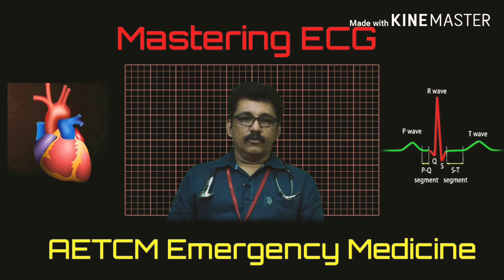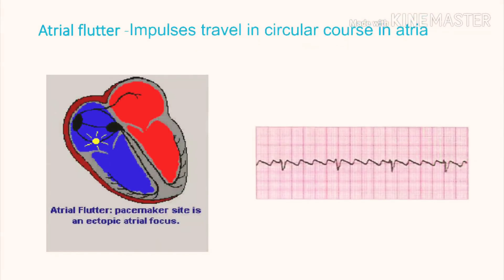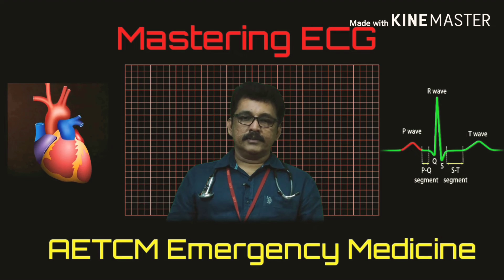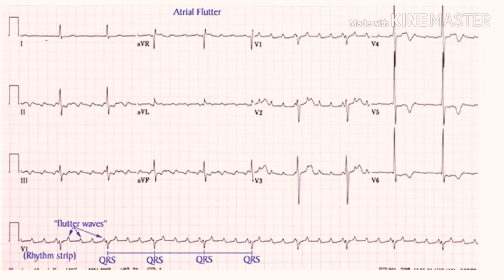This ECG shows a sawtooth appearance between two QRS complexes — a classical finding of atrial flutter. In atrial flutter, the pacemaker site is an ectopic atrial focus. Impulses travel in a circular course inside the atria, producing multiple atrial ectopics and a sawtooth-like appearance. The QRS complex may come regularly, and you may see every three or four P-waves followed by one QRS complex.